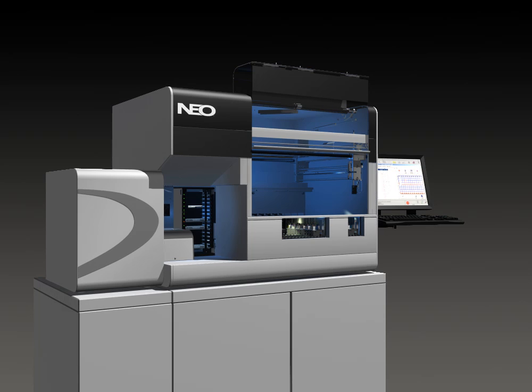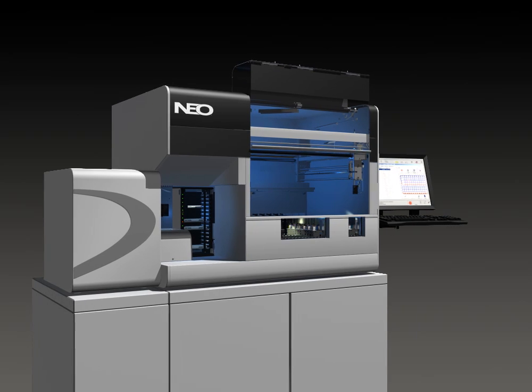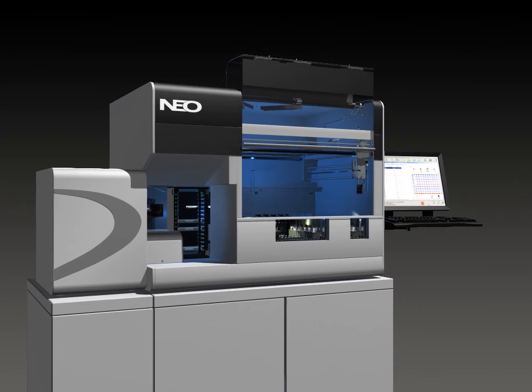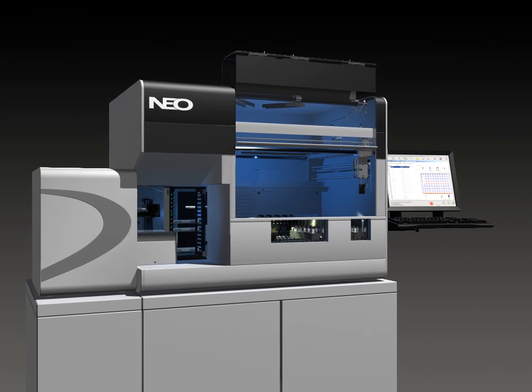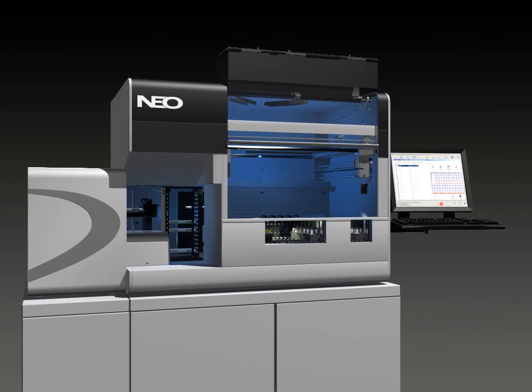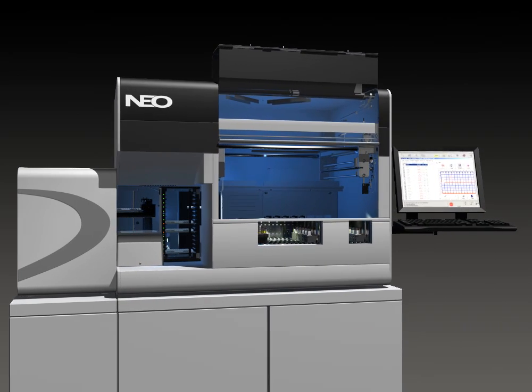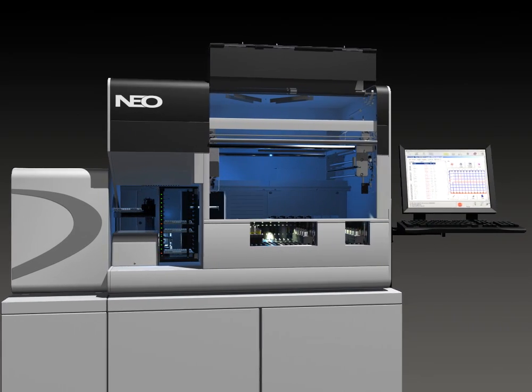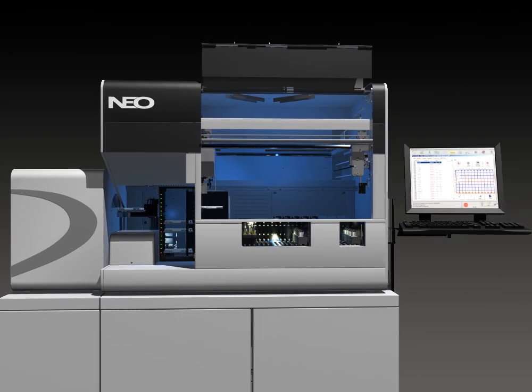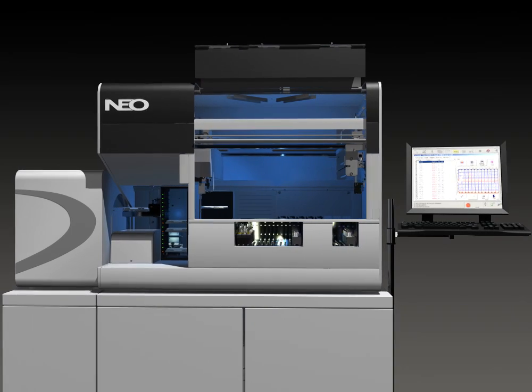NEO is ImmuCore's fourth generation fully automated instrument for blood bank and the next generation of instrumentation in the high volume segment of our scalable solutions.